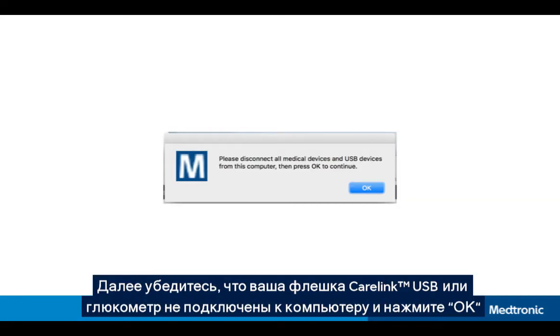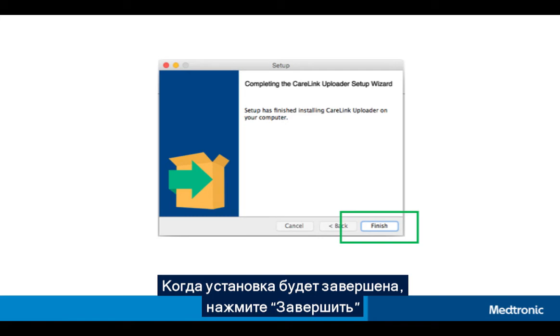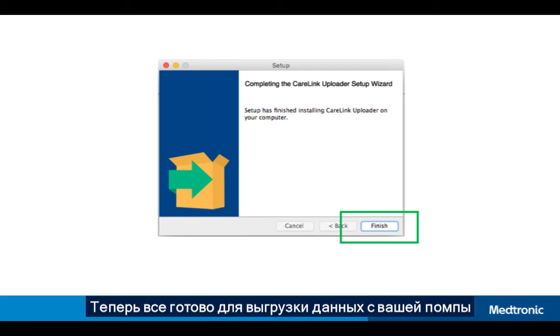When asked, make sure that your CareLink USB or meter is not plugged in and select OK. When the installation has completed, select Finish. You are now ready to upload your pump data into CareLink.